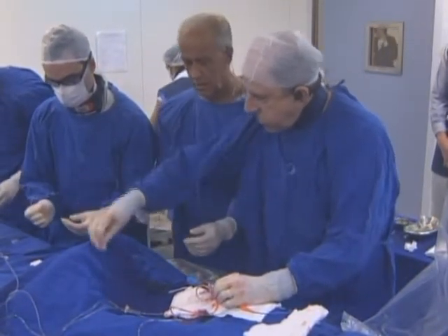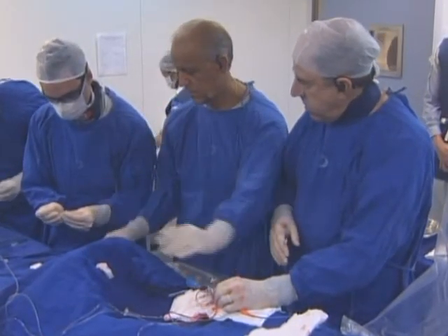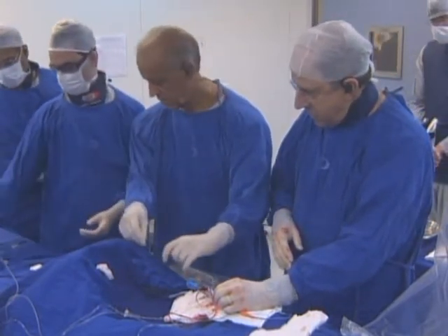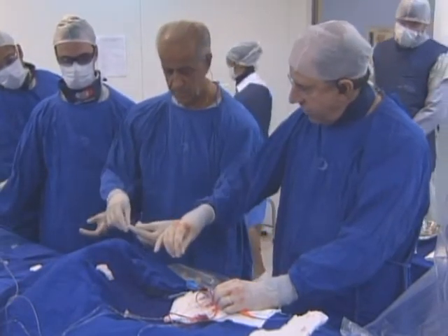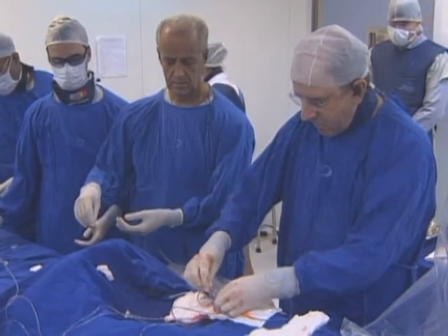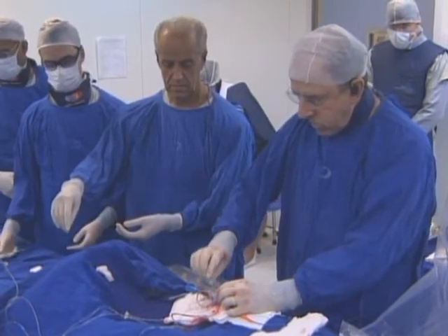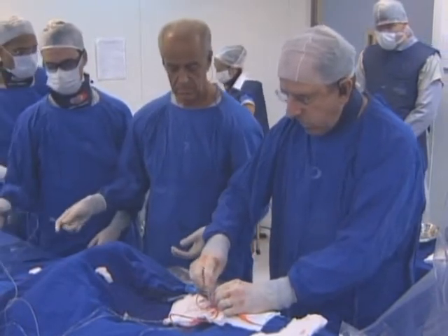While they are working, I would like to ask you or the panel, do you think that ultrasound in this situation plays any role? For example, to see whether there's really calcification involved in this bifurcation? Do you have aggressive preconditioning of the bifurcation, thinking maybe of a cutting balloon if you have calcifications? It's a long lesion in the LAD, and fairly long also in the diagonal. So I think lesion preparation, like what he did, is very important in this case.